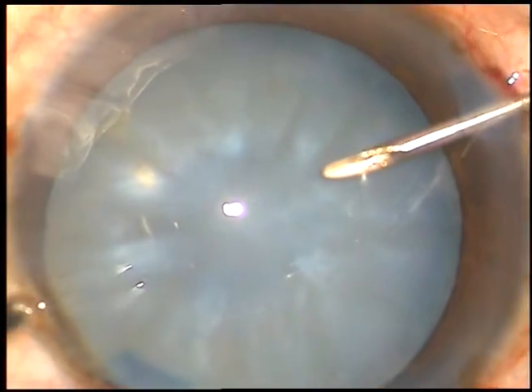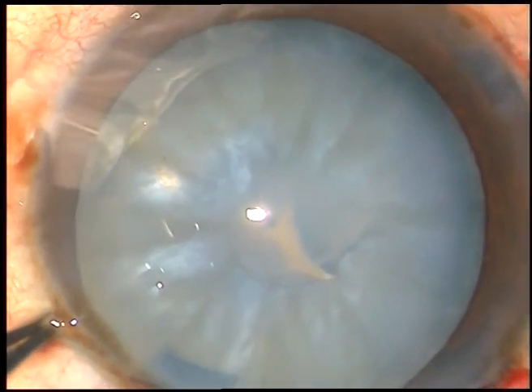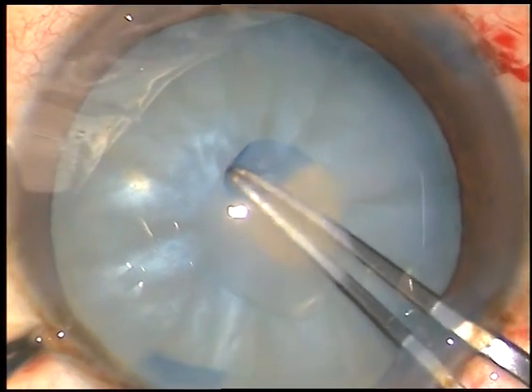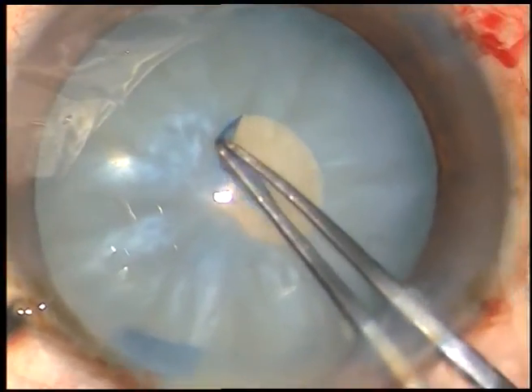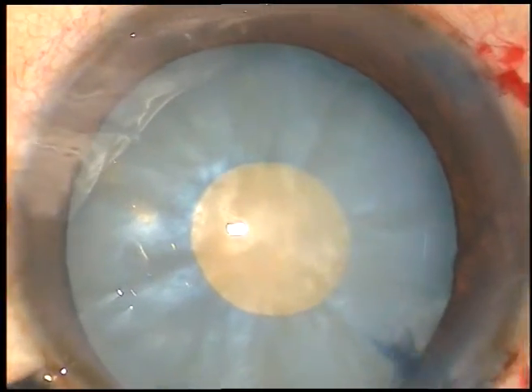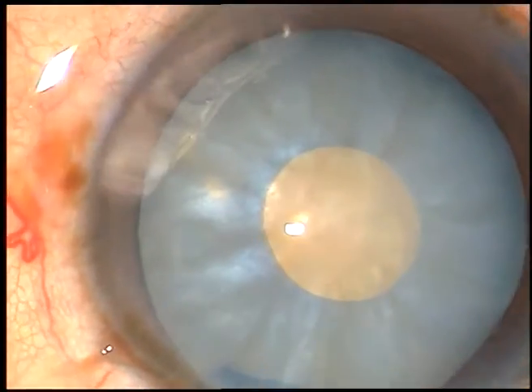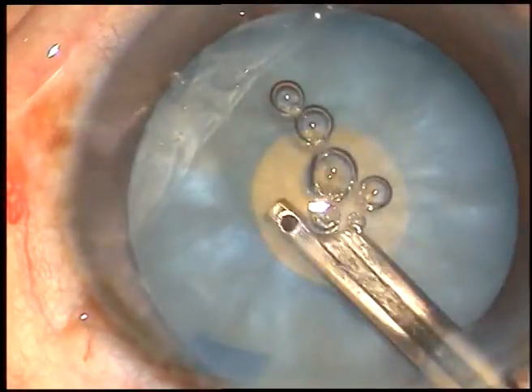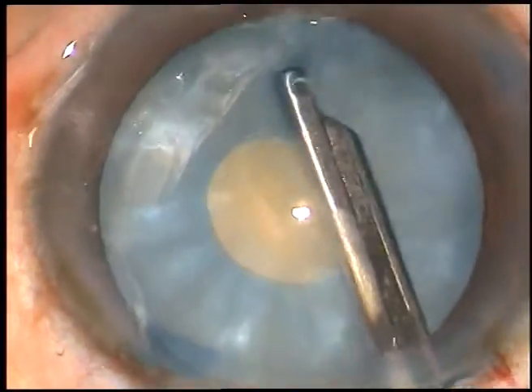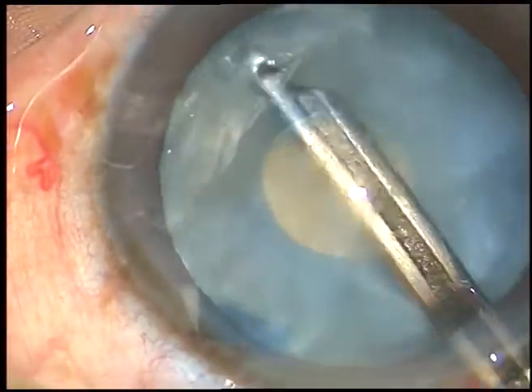Now, I incise the capsule and make this flap. It is a curved flap. Hold this flap. And at this stage, I do a very small rhexis — I call it a mini rhexis. And now, through this opening, cortical matter is aspirated to reduce the intra-lenticular pressure.